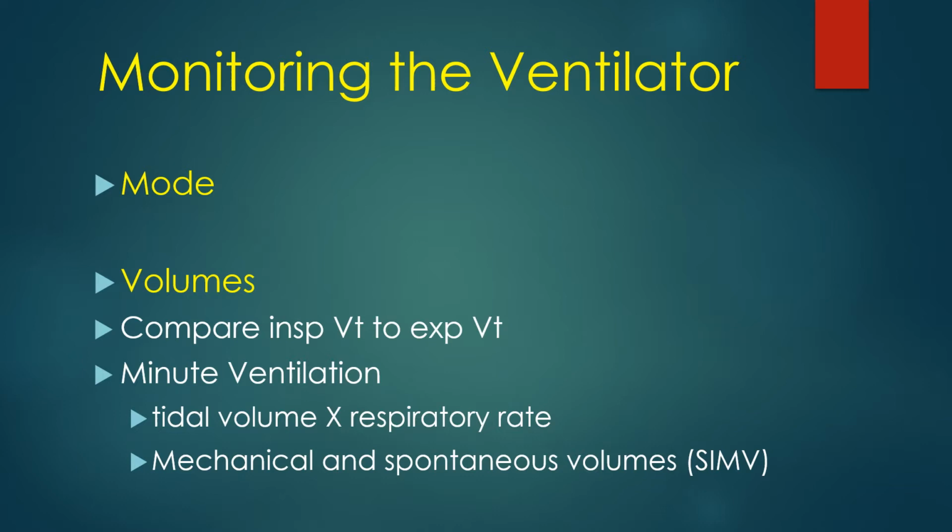Another problem could be related to those chest tubes. Remember when we walked in the room and we saw chest tubes? He may have a bronchopleural fistula, and the patient gets a 500 tidal volume, but 100 goes out his chest tubes. He has a large bronchopleural fistula. And so that would explain where that tidal volume is going.